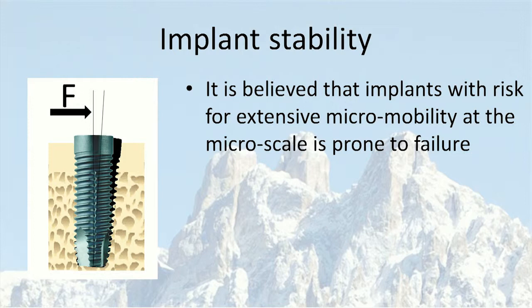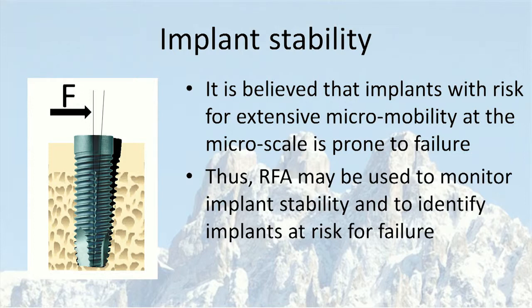So we believe that implants with risks for extensive micromotions in the bone bed are more prone to failures than more stable implants, so to say. So if the RFA technique is measuring displacement, the technique can of course be used to identify these implants and also to monitor development of implant stability after implant placement.